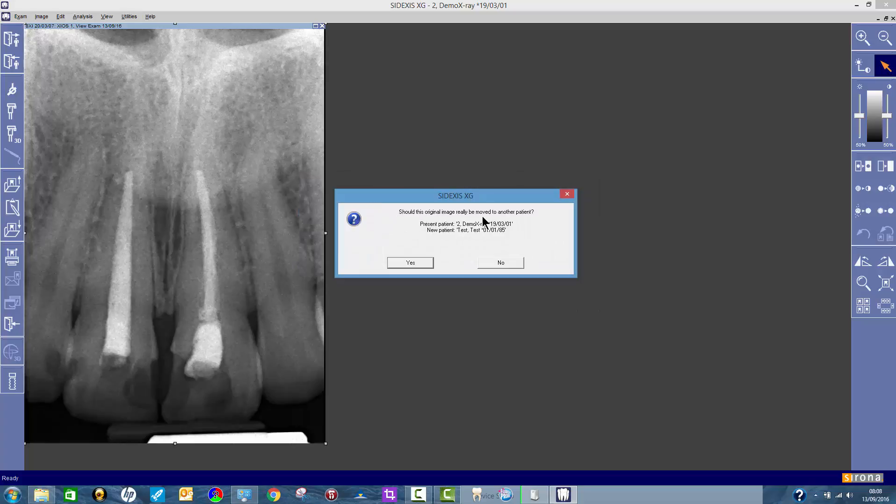It says should this original image really be moved? Present patient this one, new patient this one, do I want to move it? Yes I do.